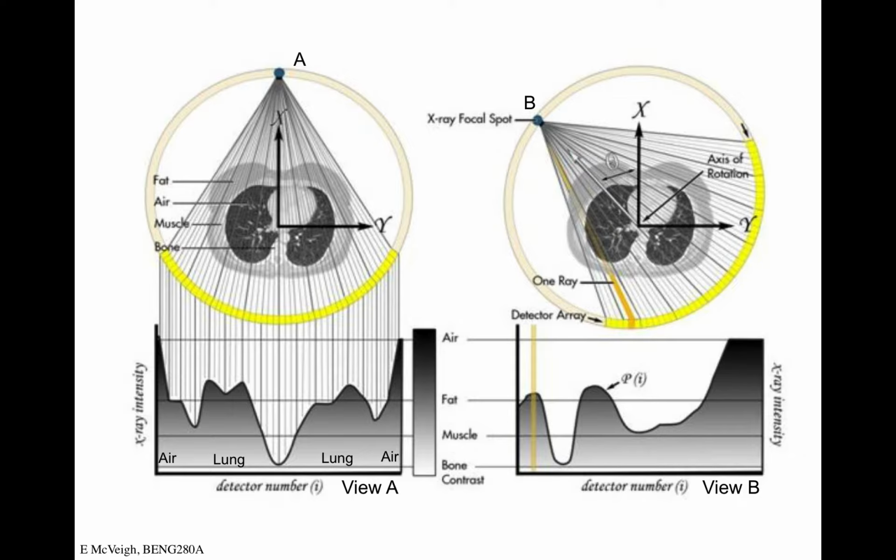And so we read out a voltage on each detector over a certain time and plot that, and it's proportional to X-ray intensity. There's some scaling, you have to do dynamic range adjustments, because some of the detectors will have an enormous signal and some will have a very low signal, so there's a lot of encoding that goes on, but the basics are pretty simple.